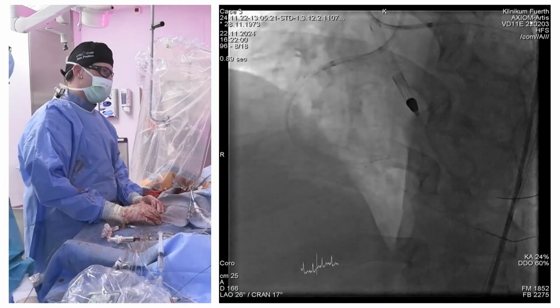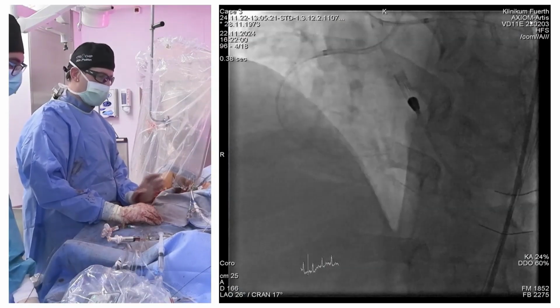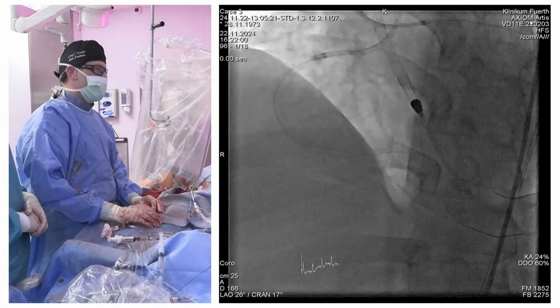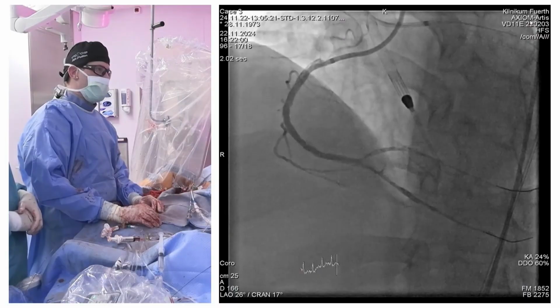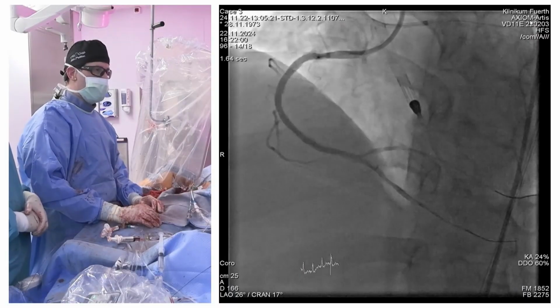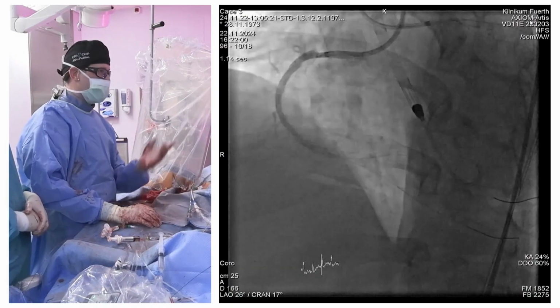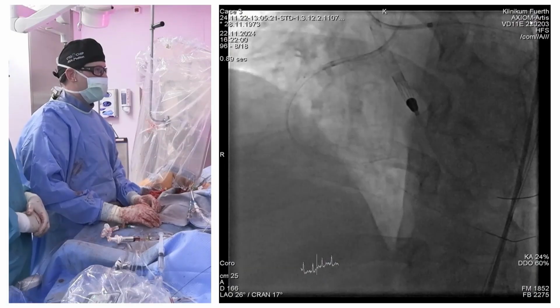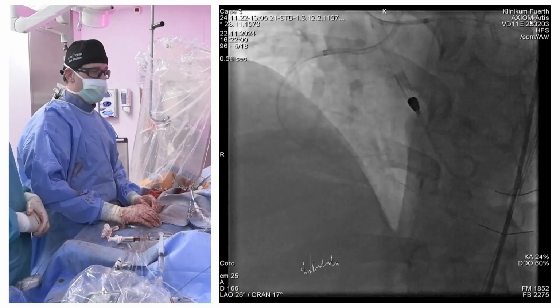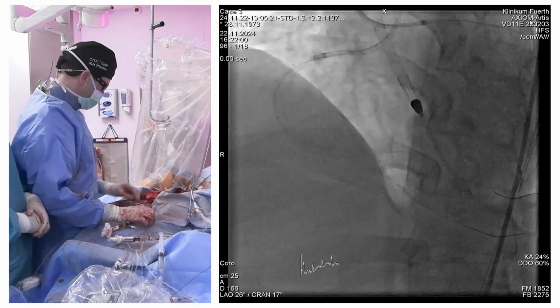Honestly, I think most of them are working. I'm not sure about some special balloons, but most of them we have in our hands are working. And I think it's a minor issue of which one to use. They're probably all working, and this is a case I would definitely do an angio control again to determine if this was the right decision to just DCB. Especially looking at the guidelines right now, right?